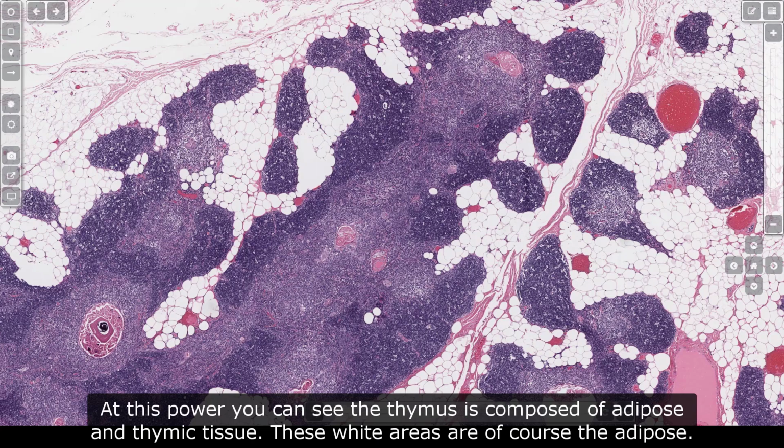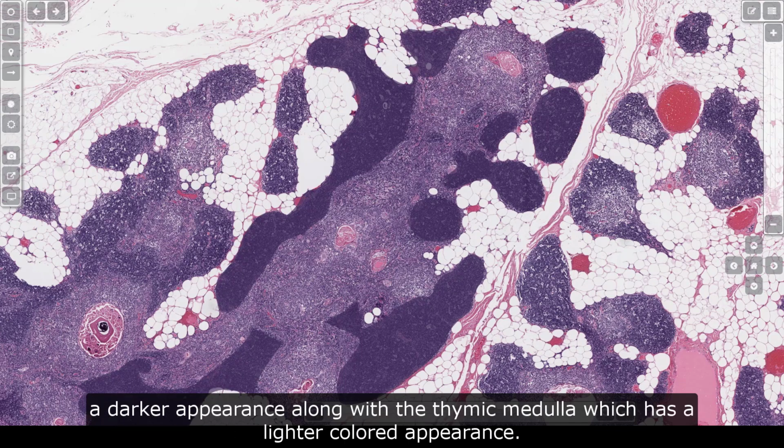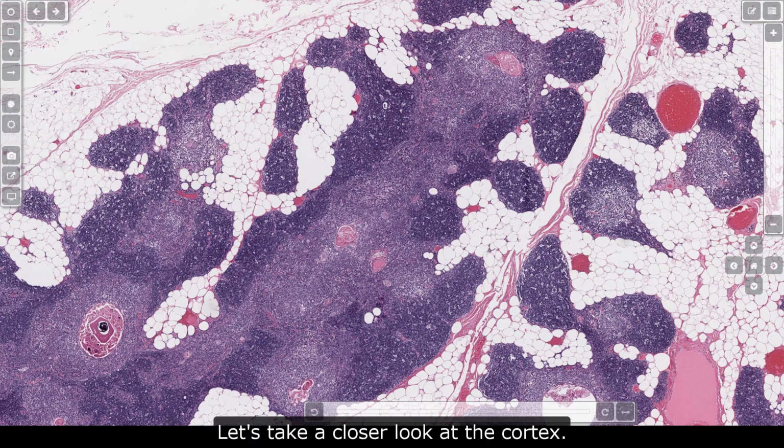At this power, you can see the thymus is composed of adipose and thymic tissue. These white areas are, of course, the adipose. The darker blue or purple areas are thymic tissue. At this power, you can see there is a thymic cortex, which has a darker appearance, along with the thymic medulla, which has a lighter colored appearance. Let's take a closer look at the cortex.